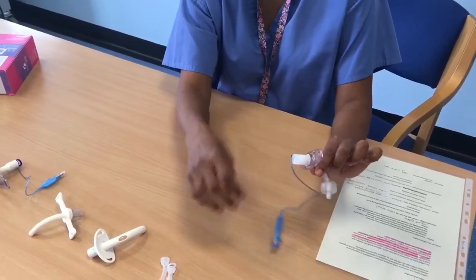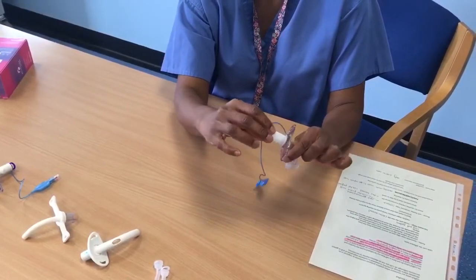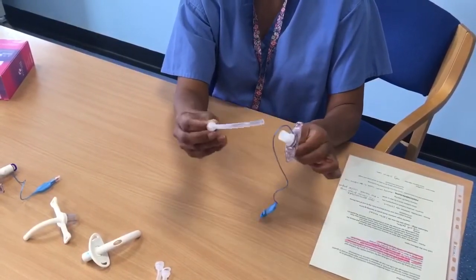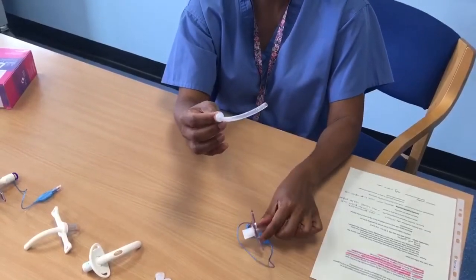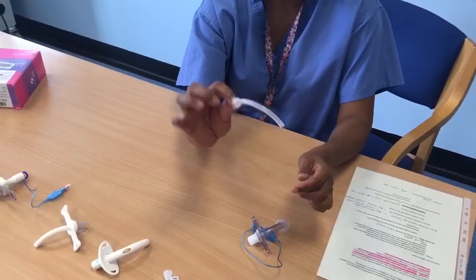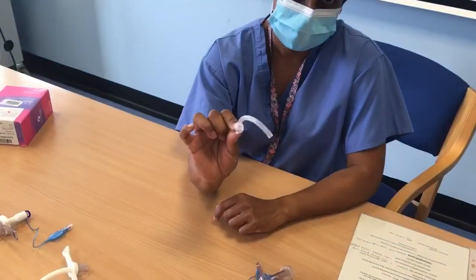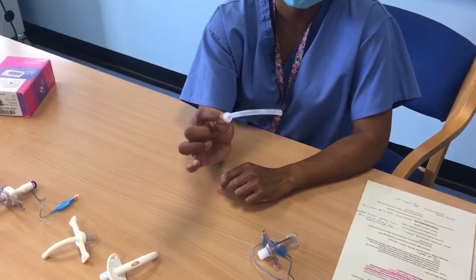You'll notice there's a ring pull. This is actually the inner tube. So just be careful with the ring pull, because they can snap, so not to be too rigorous with taking out the tube. And we see the inner tube of the tracheostomy.